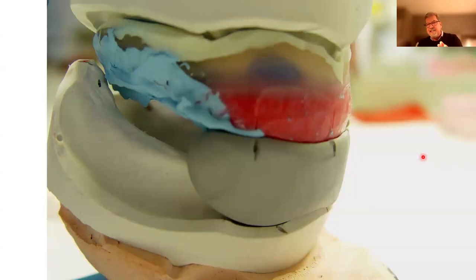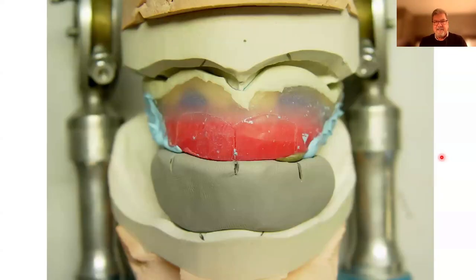And then this is the case we talked about earlier. This is that functional impression with an occlusal record here. So I want to follow the doctor's guidelines in here. I have to make a new base plate for this. So I'm going to toss aside this occlusal record and the impression, and I'll make a new base plate. But I want to make sure I capture what the doctor gave me here: the midline, the canine lines, and the height. So I make a little putty index here, and this is going to help me set my denture teeth.